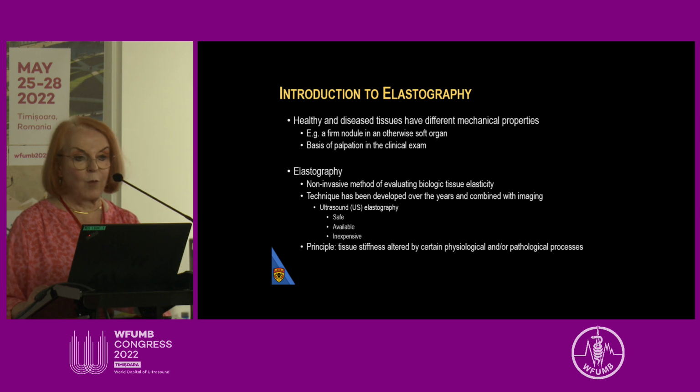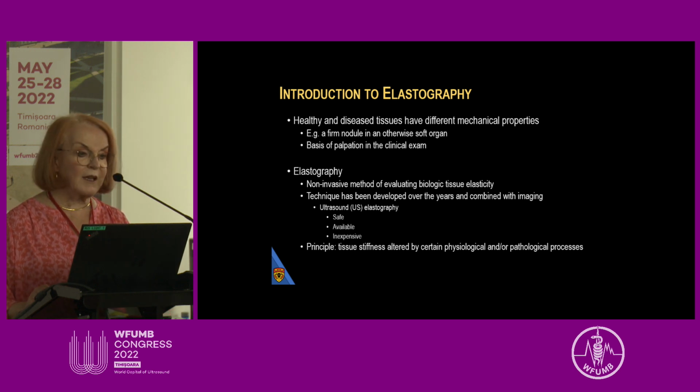What was our introduction to elastography? We recognize that healthy and diseased tissues have different mechanical properties. I always remember as a student learning that palpation of a nodule was the first evidence that tissues change when they develop inflammatory or neoplastic change. That's the basis of palpation in the clinical exam.